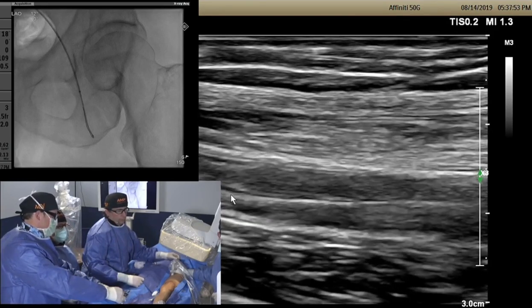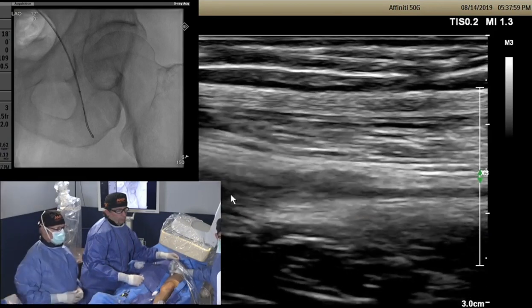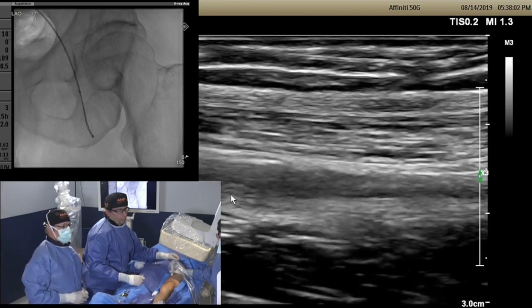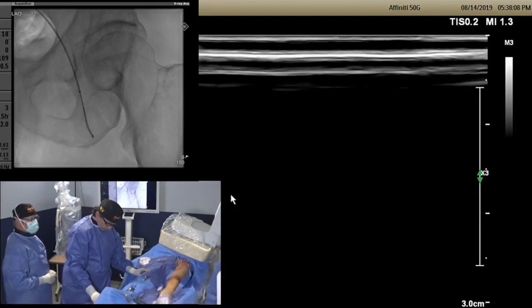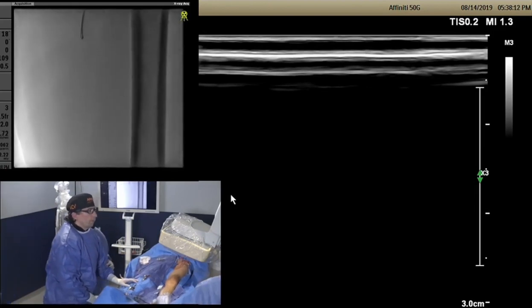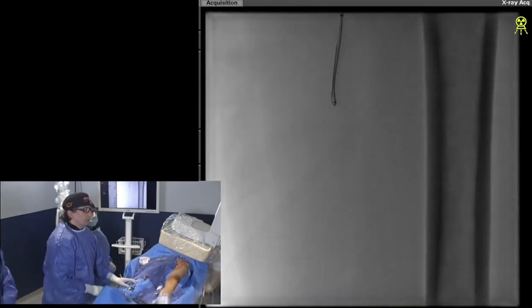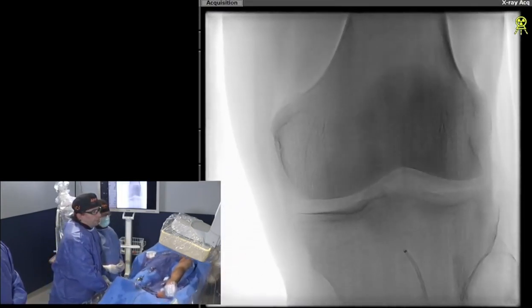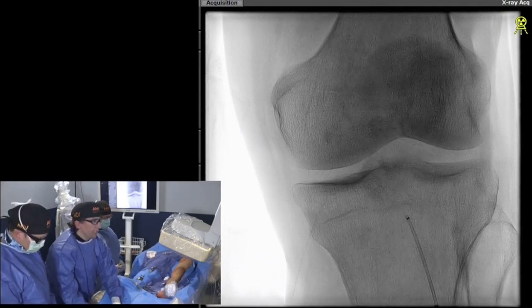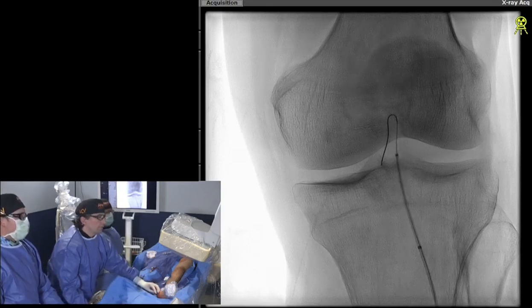The concern is jeopardizing the profunda. At this point, would you switch access and get into the true lumen? If you're in a subintimal plane up where the profunda is — totally agree. He's going to try to do that, and then the entry point has to be near the profunda so you can push things away if needed. We're already up to the mid SFA, and I have a Navicross catheter from below at the distal CTO cap with an 018 Command wire.